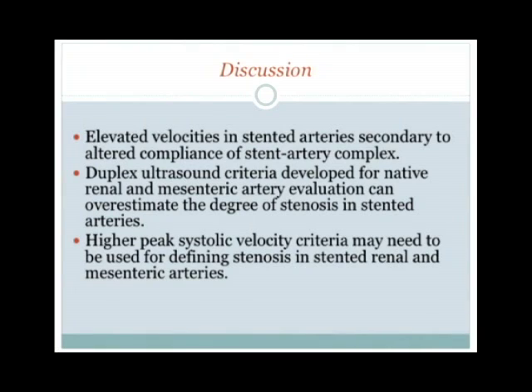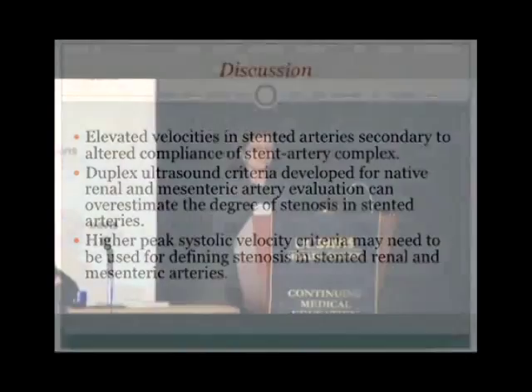And the importance of follow-up, obviously, with duplex ultrasound and also following closely the patients and their clinical status is important. Currently, at UC Davis, we're trying to look into that. Dr. Aaron Baker, who's one of our residents, is looking at all our data with renal and mesenteric artery stenting, and we have a student, Victoria Chu, who's also looking at that, hoping to see if we can establish some criteria for our own lab in terms of what velocities we should use, and when we should intervene on these patients. When is a velocity increase significant enough for us to potentially do another intervention on the patient?